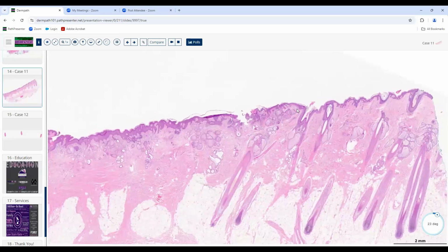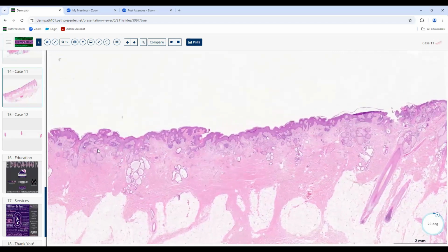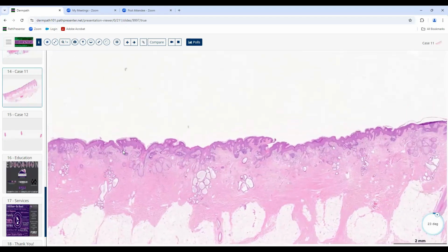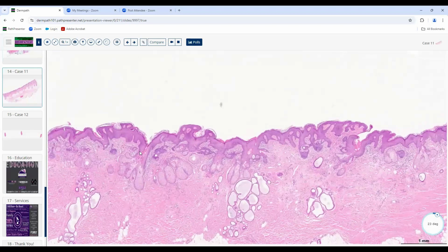And then you get to this zone, and notice where these sebaceous lobules are. They're not associated with any hair follicle, and they're touching the epidermis. They're way up here in the epidermis. And that's not where they belong. They should be associated with hair follicles. Here's a follicle that's bizarre. It's only got an infundibulum. It has no inferior portion.